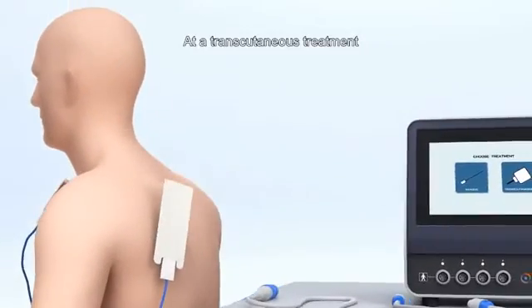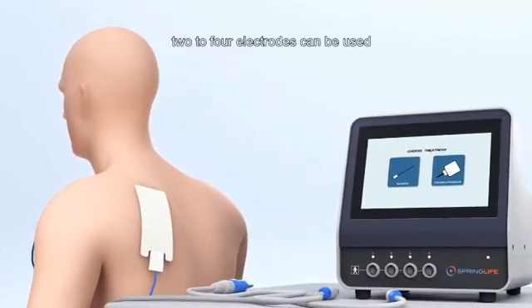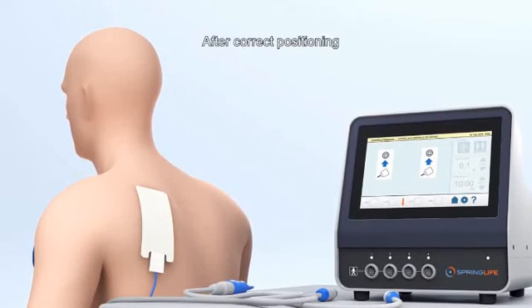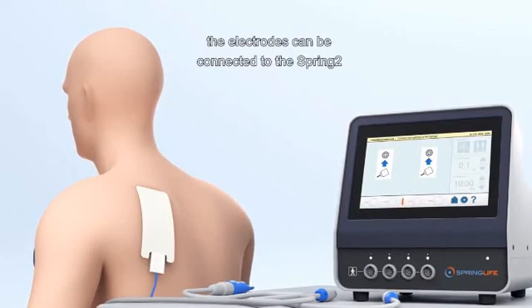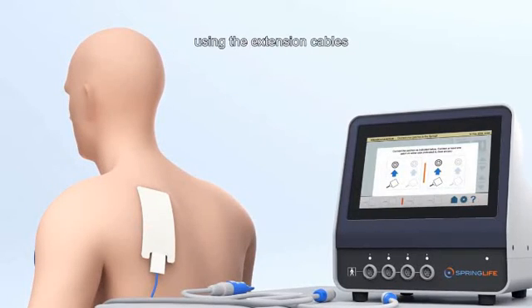In a transcutaneous treatment two to four electrodes can be used. After correct positioning the electrodes can be connected to the Spring 2 using the extension cables.